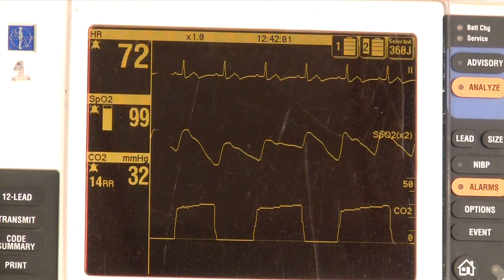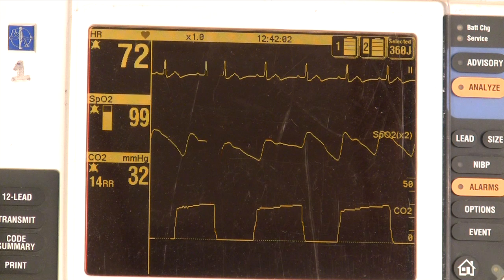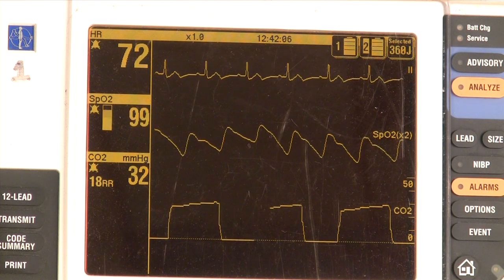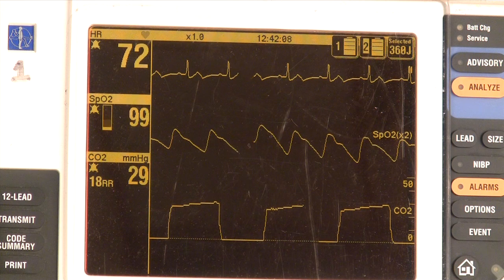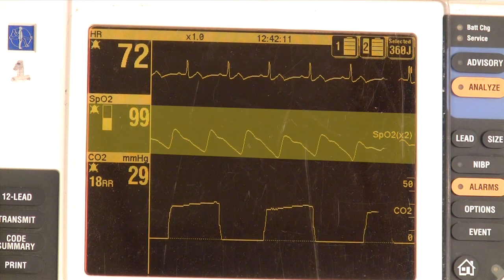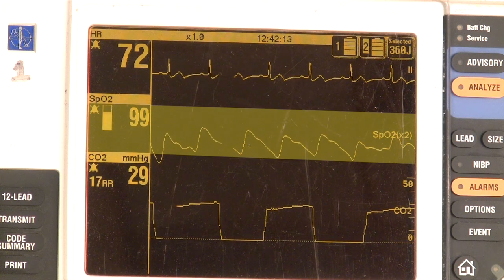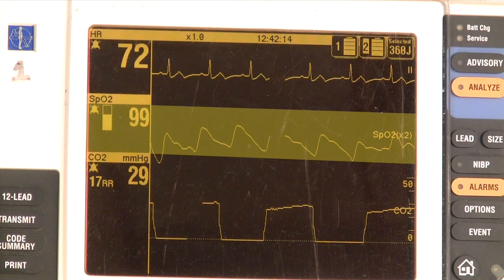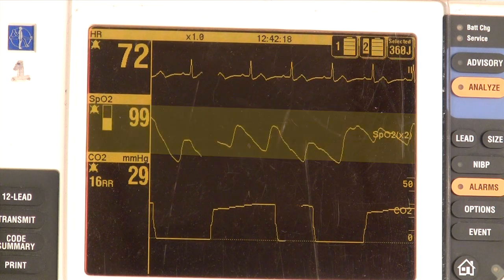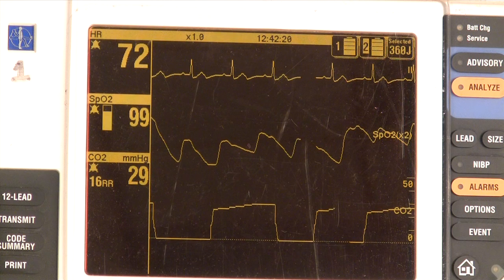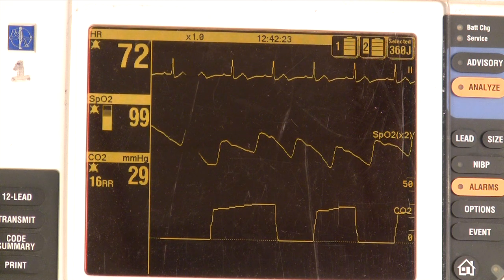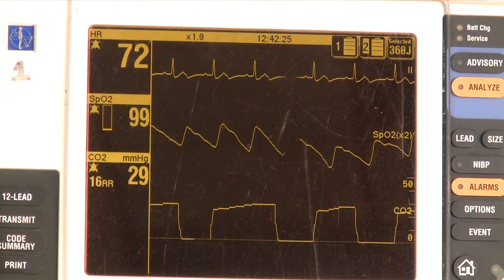In the case of the perfusing patient, capnography becomes important to tell whether the patient is underventilated or overventilated. In conjunction with SpO2 or pulse oximetry, it can be a very valuable tool. Pulse oximetry will tell you what has happened over the past two or three minutes. Using waveform capnography, you can actually predict whether the patient is going to be in trouble or not.